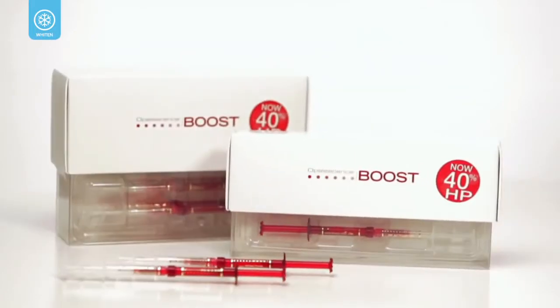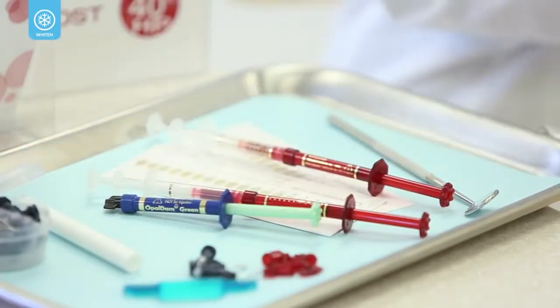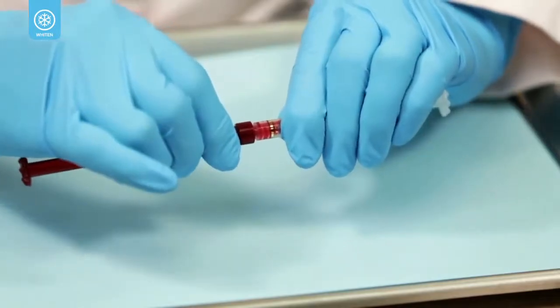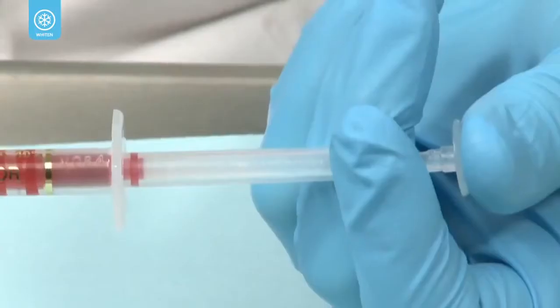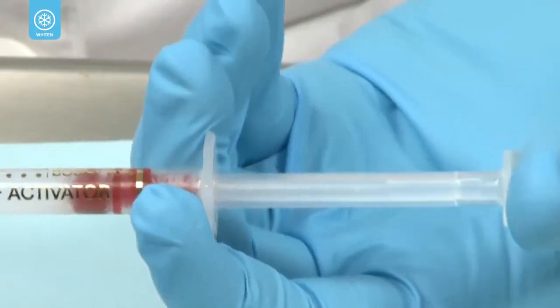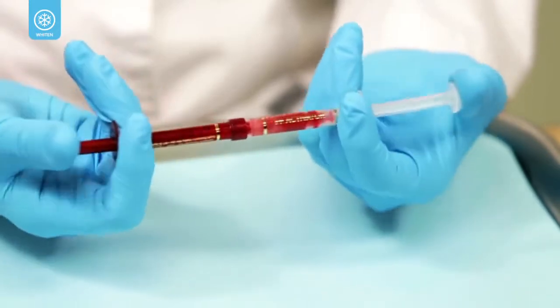Because Opalescence Boost is chemically activated, it needs to be mixed just prior to placement. Before mixing, check that the red plunger is securely attached to the clear plunger. Depress the red plunger, forcing the contents of the red syringe into the clear syringe. Quickly and forcefully depress the small clear plunger into the middle small clear syringe to rupture the internal membrane. Doing this combines the bleach and activator.